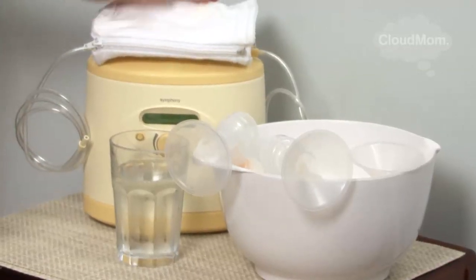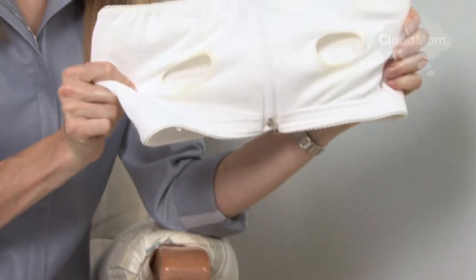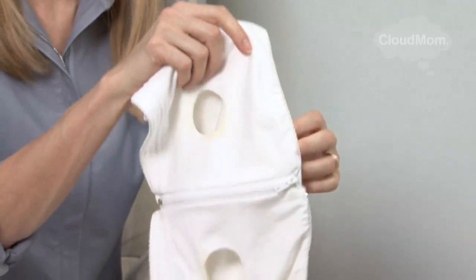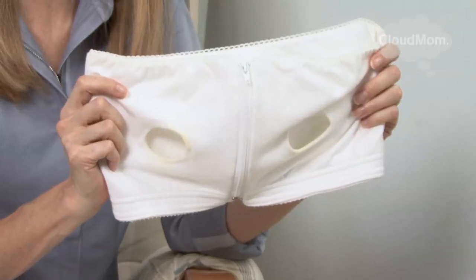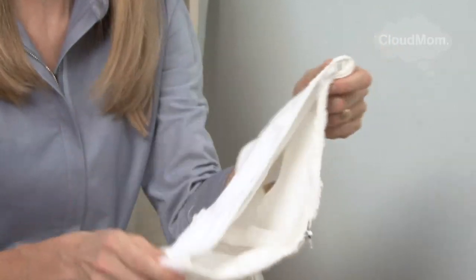On top of the pump I would put my handy little easy expressions bra or bustier. This is a really great thing to have because you can strap it around your middle, and in these holes you put the breast shields so that while you're pumping you can do other things like talk on the phone, file your nails, or eat your lunch.